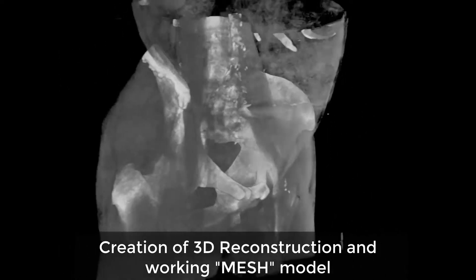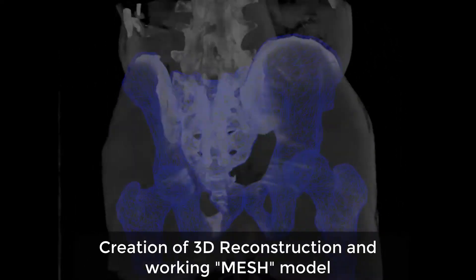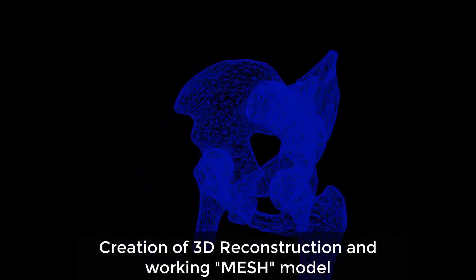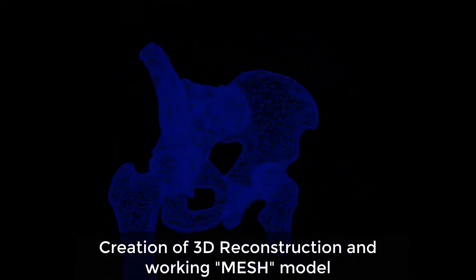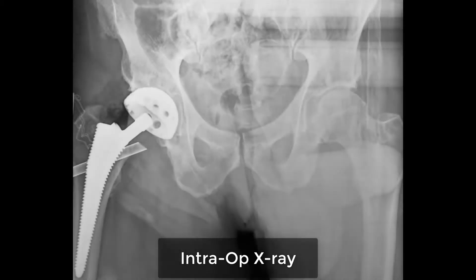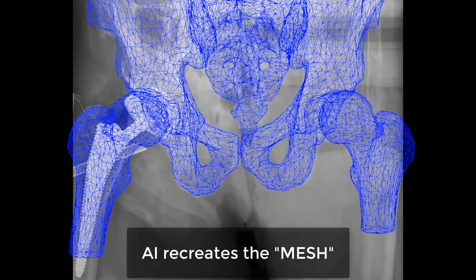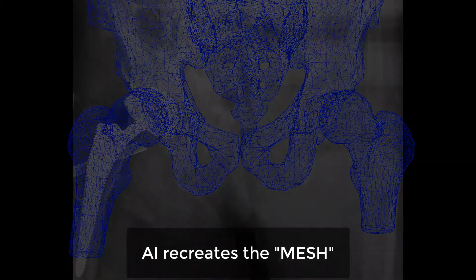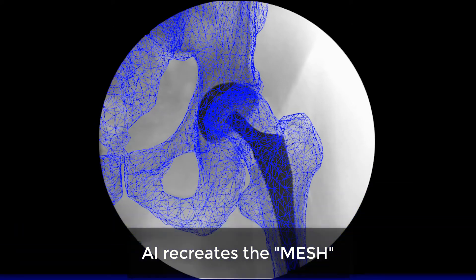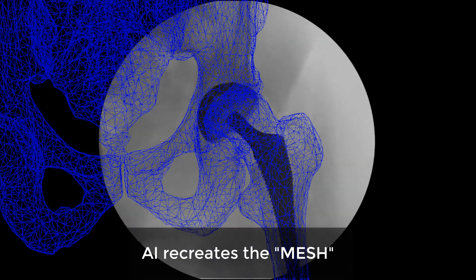Beginning with a preoperative CT or MRI 3D reconstruction, RadLink AI creates a working mesh model. Utilizing the hospital's existing radiology equipment, RadLink allows surgeons to capture and analyze an intraoperative X-ray. From this X-ray, AI recreates the 3D mesh model without the use of pins or arrays.